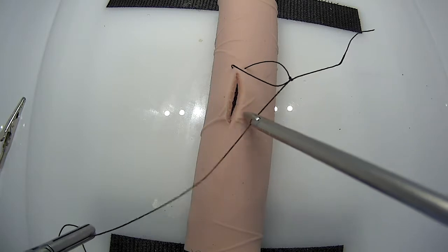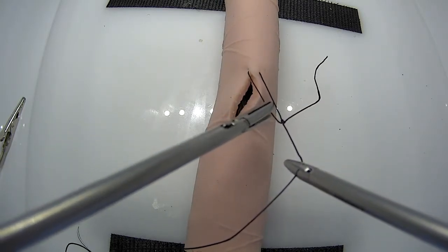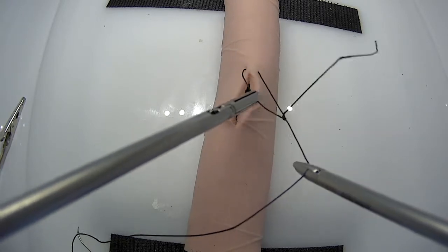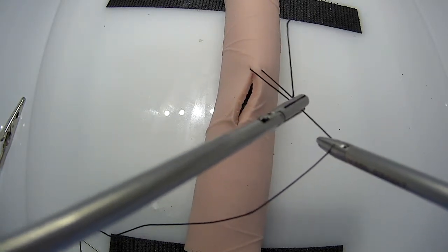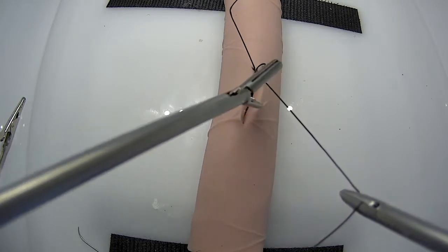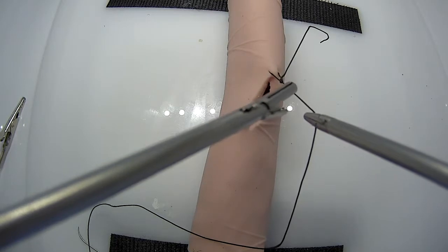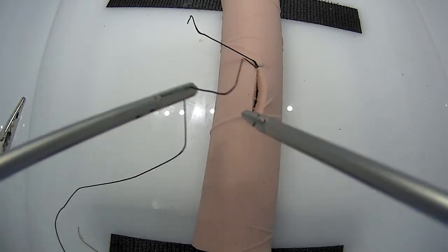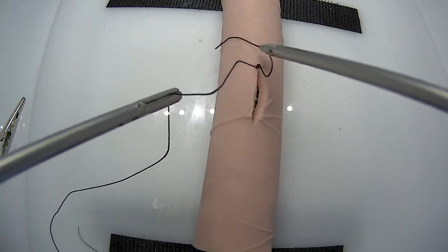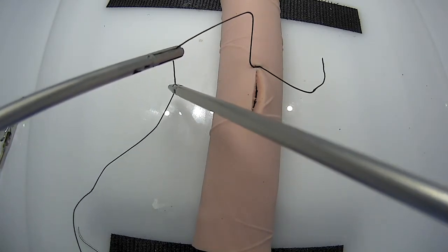Take the body of the suture, bring it towards 5 o'clock. Push on the opposite leg till the knot pops. Now you can push the knot down, the slip knot. Repeat until that knot is cinched down. Now you're going to lock it, you're going to bring these apart horizontally, and you're going to place 2 additional throws.